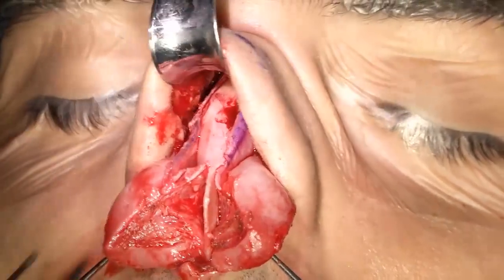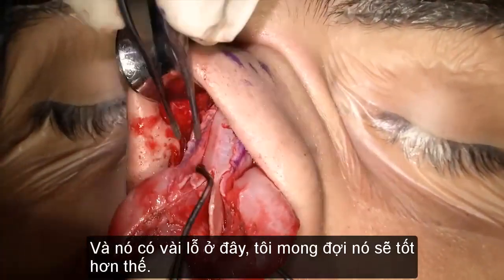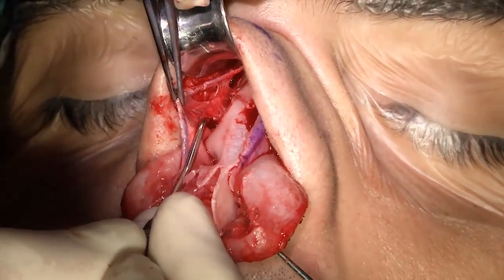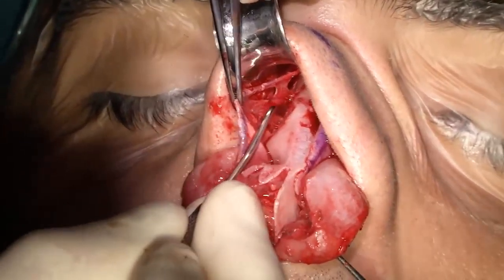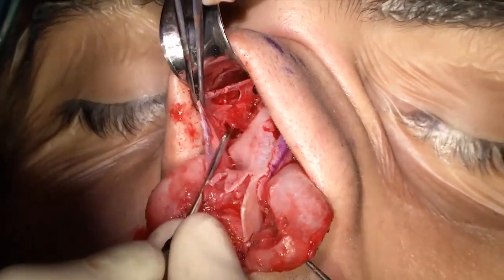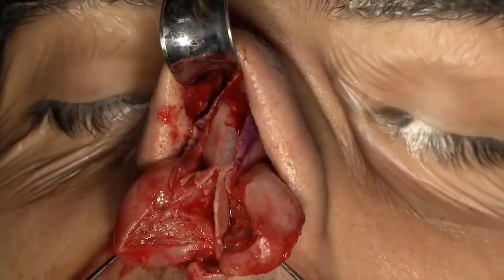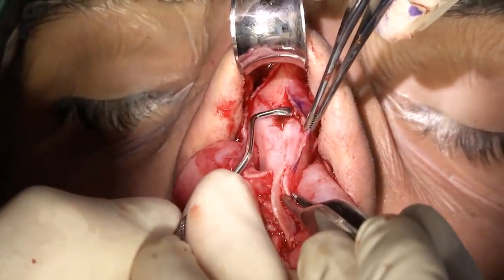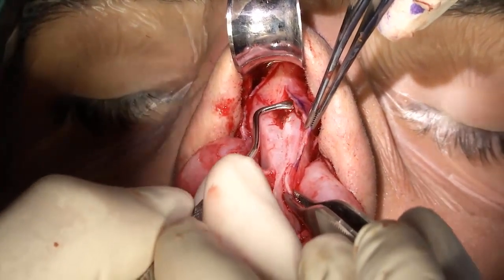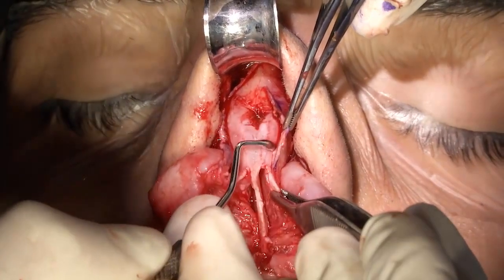And that's it. It has a couple of holes, actually. I was expecting it to be a little bit better than this. So it's kind of flimsy. So let's have a look at how to do it on this side. This is above the nasal bone here, and that's the ligament.